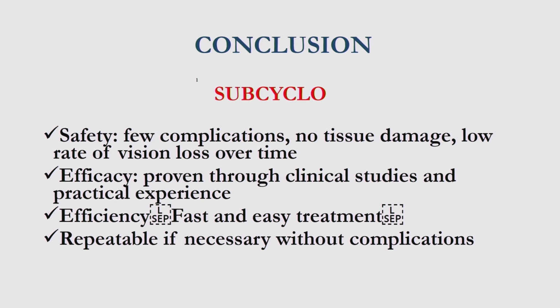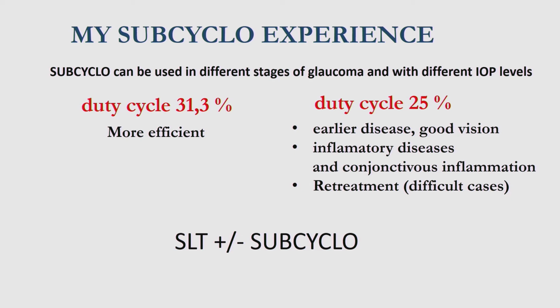So SubCyclo can be safe and effective to treat glaucoma. In my experience, I use it in the different stages of glaucoma and with different levels of IOP.